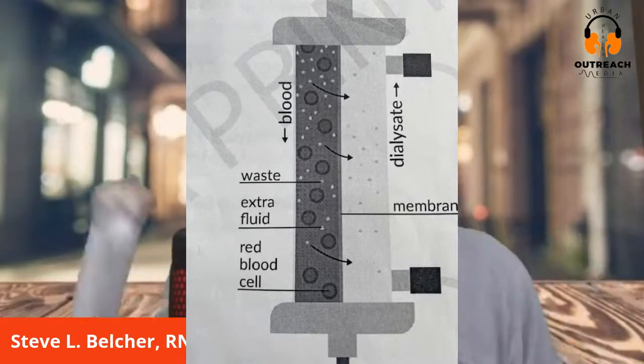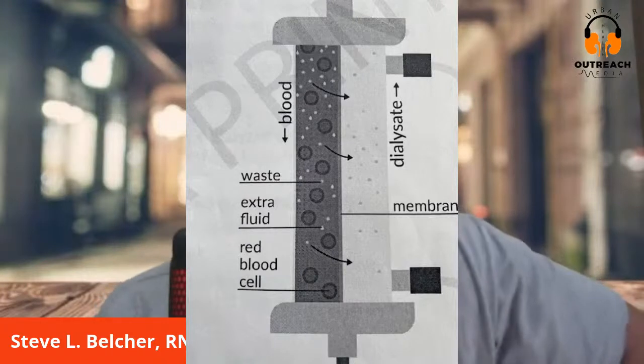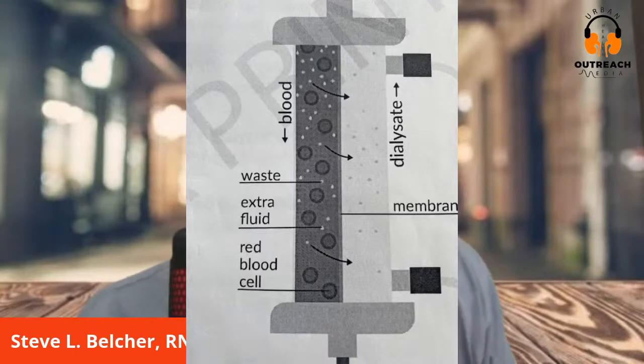And the fluid goes out there into the drain. But if you look at this picture, you see where it says blood and dialysate? One side is half dark and half light. In the middle of that, there's something called a semipermeable membrane that keeps the dialysate and the blood from mixing. If that happened, man, it would be some mess going on. That membrane separates the blood and the fresh dialysate.